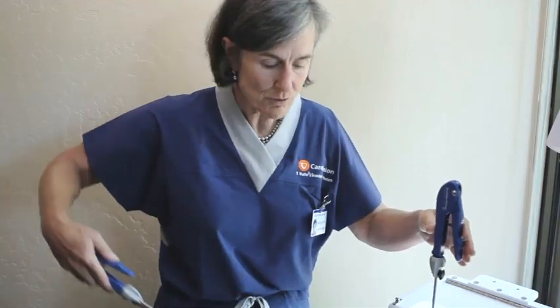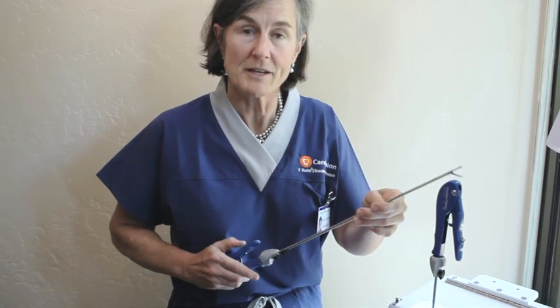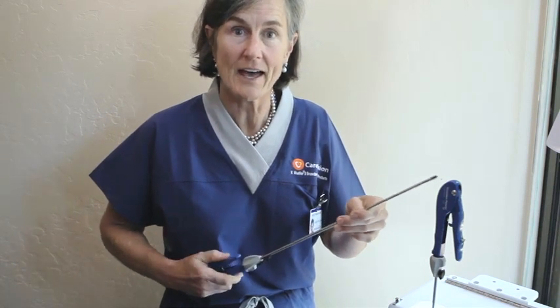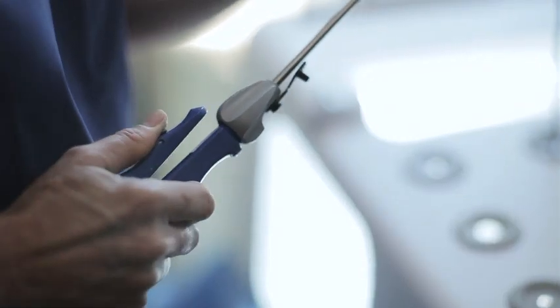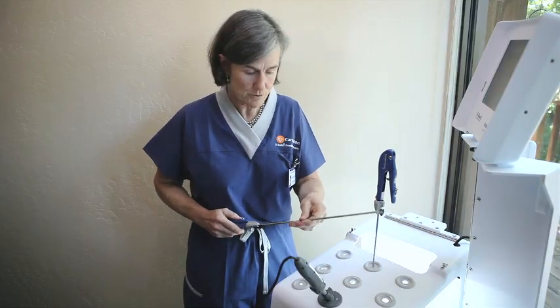I use a ratchet on my needle driver because I definitely need to have a strong grasp of the needle so that it doesn't wobble when I am suturing.